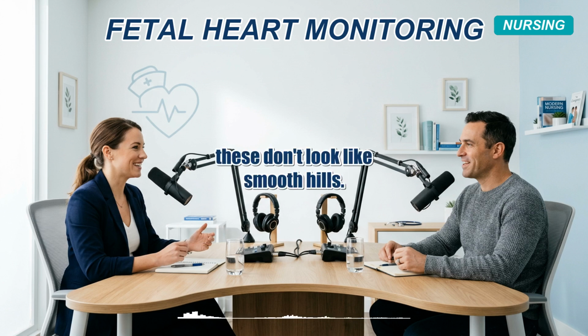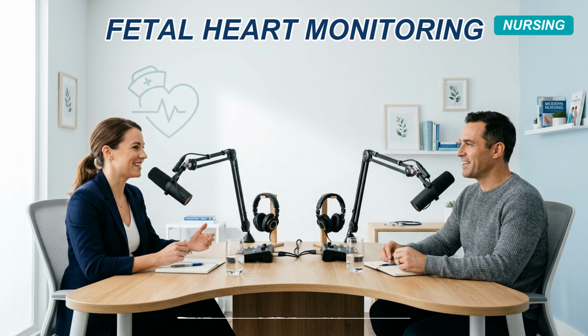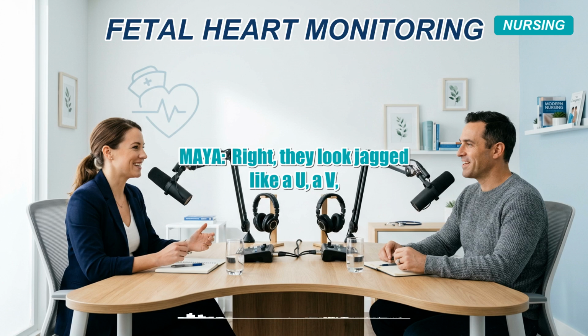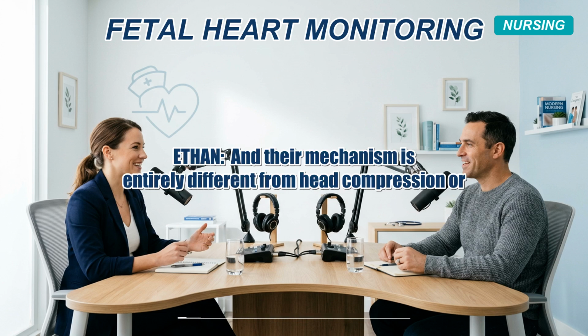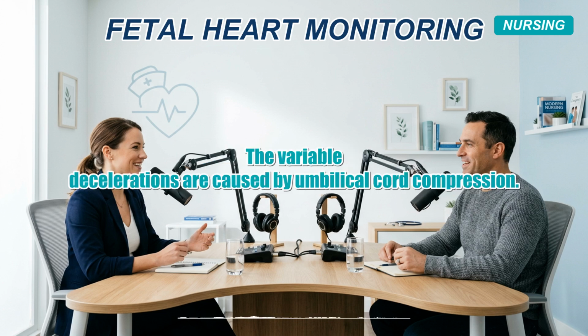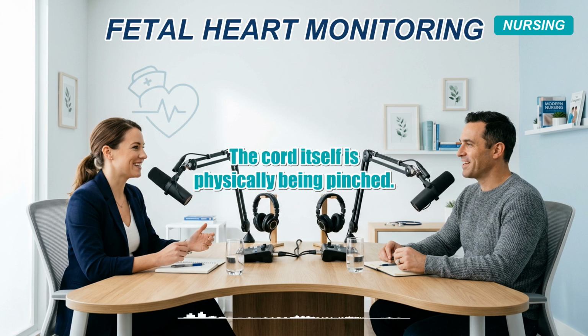On the monitor, these don't look like smooth hills. They have an abrupt onset and an abrupt return, usually dropping and recovering in under 30 seconds. Right, they look jagged, like a U, a V, or a W shape scribbled on the paper. And their mechanism is entirely different from head compression or placental insufficiency. Yes, completely different. The variable decelerations are caused by umbilical cord compression. The cord itself is physically being pinched.